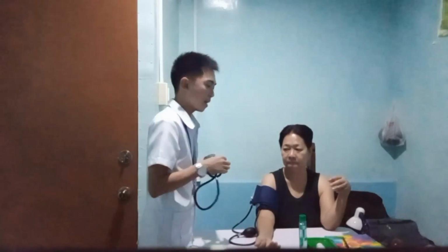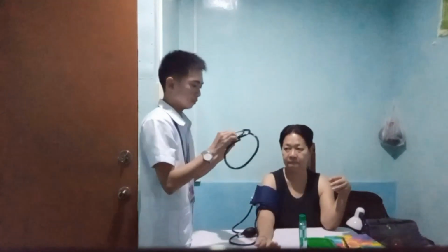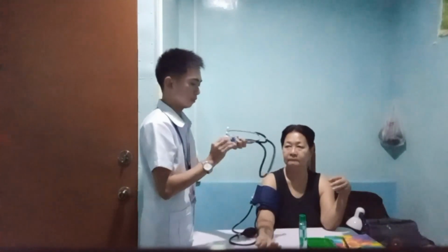Now, clean the earpiece, diaphragm, and the bell. Then put the earpiece in your ears, ensuring it hangs freely. Put the stethoscope on the skin and not on the clothes. Hold it with your two fingers.